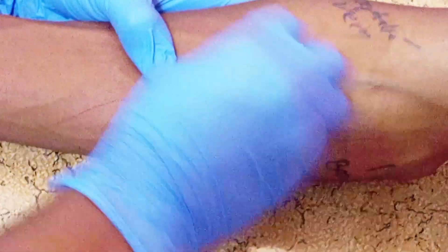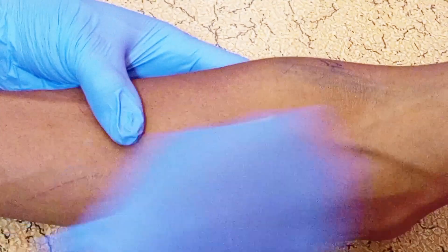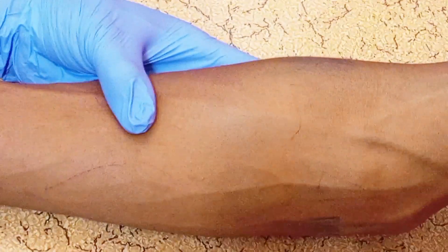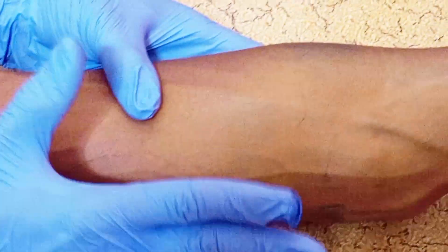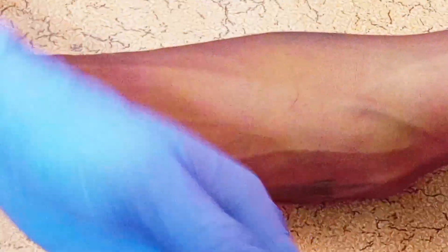The first step is to apply an alcohol swab gently on the area. Allow the skin to dry first before you start drawing the blood. Then get your syringe and attach it to the butterfly needle.